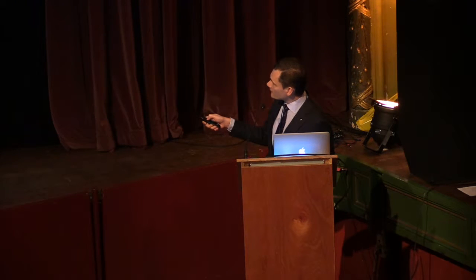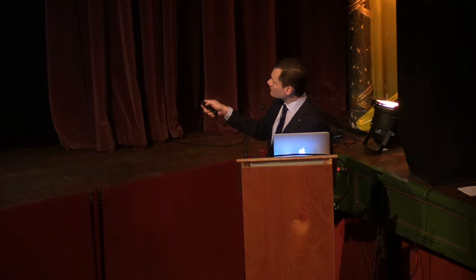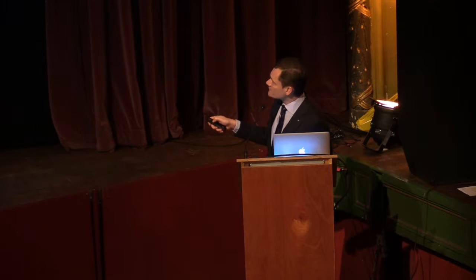And you have a steerable catheter, most of the time using radio frequency energy. And on top of the slide, you can see those so-called electroanatomical mapping systems. So this is a merge of a CT and a map created using these catheters. And the red dots are the lesions we've made.